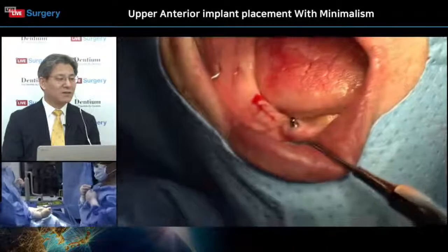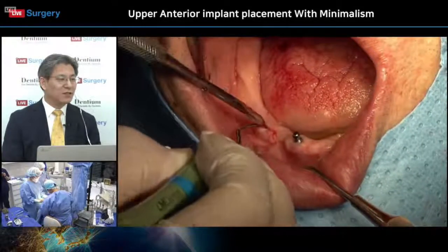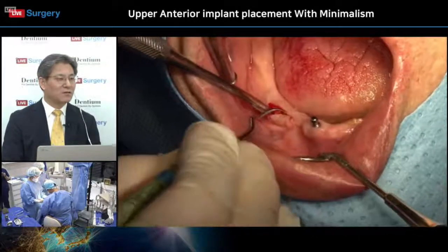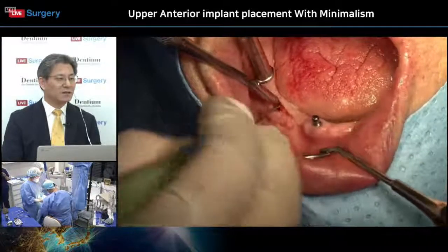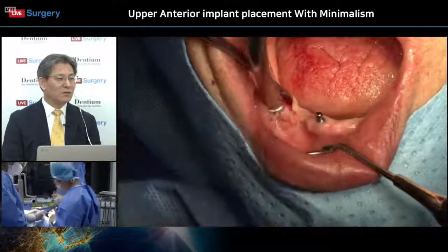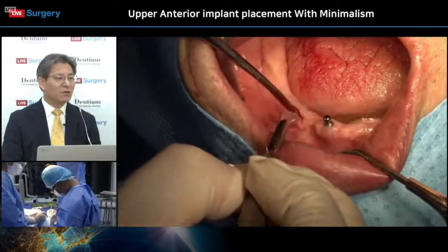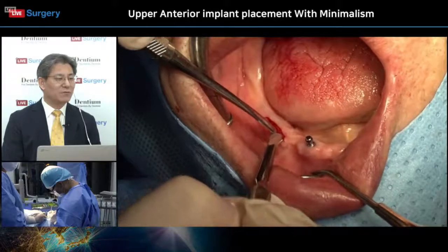Lots of experience contributing to the freehand surgery. Reflection for checking the width of the bone. During this procedure, we can check bone qualities and bone quantities using instrumentation.